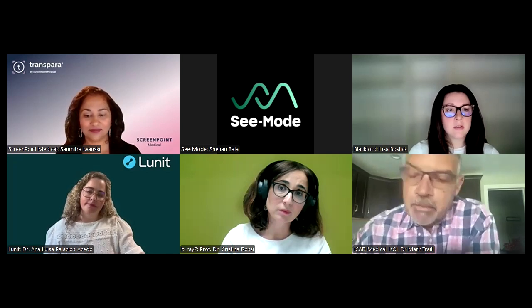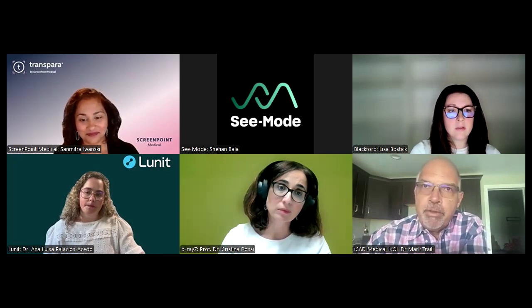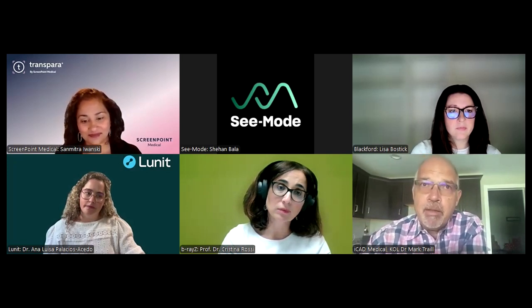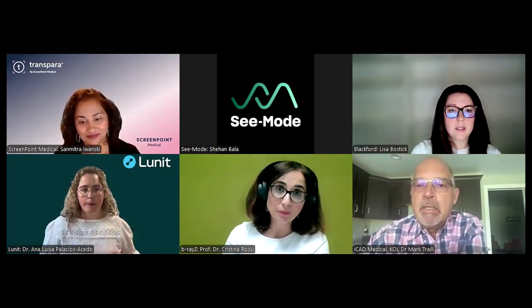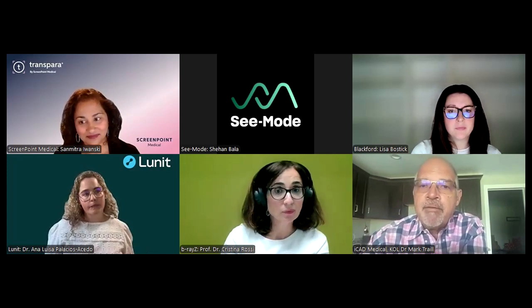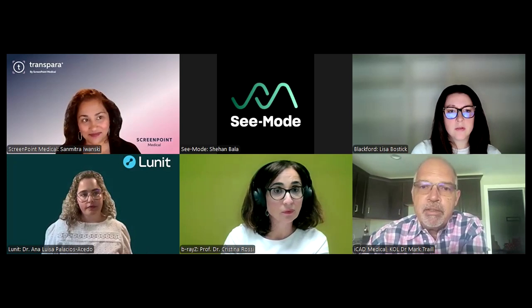Thanks, Lisa. Yes, it's helpful for that also, as well as for detecting lesions. And when you look at the scores and how they distribute, telling you that there's nothing there actually is more of an autonomous function for the algorithms in general than cancer detection. So it's a very confident output when the algorithm is telling you that there's nothing there.